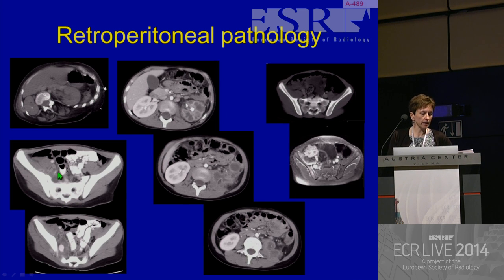So here we can see a child, they had, on the bone windows, sacral osteomyelitis. You can see the abscess here, and that certainly tracked further cephalad. This child had a retroperitoneal abscess, extended into the psoas muscle, was drained by one of my interventional colleagues, but sadly ended up, I'm afraid, getting a second CT because, as a complication of his drainage, he got a pseudo-abscess. He later had to go for conventional drainage there.